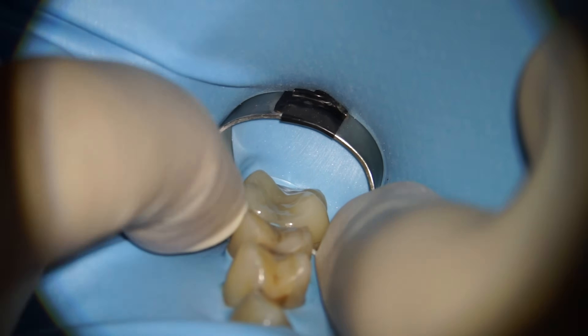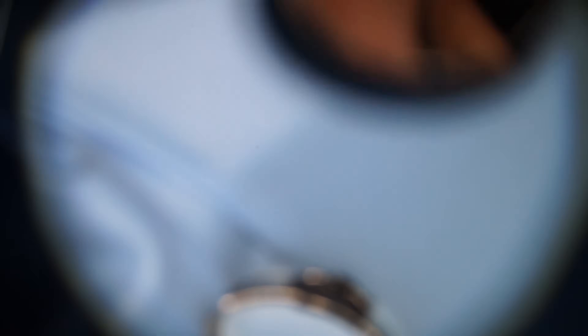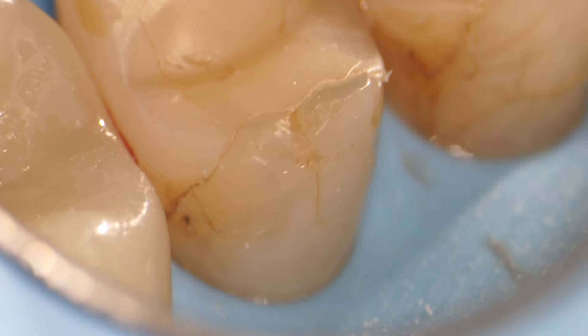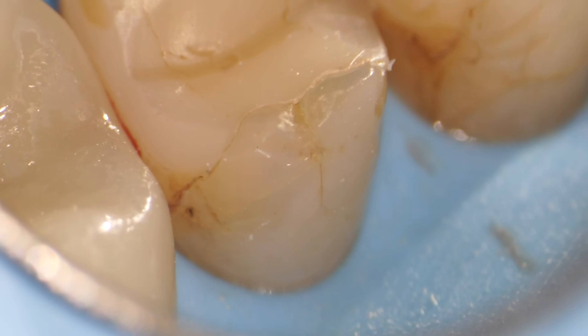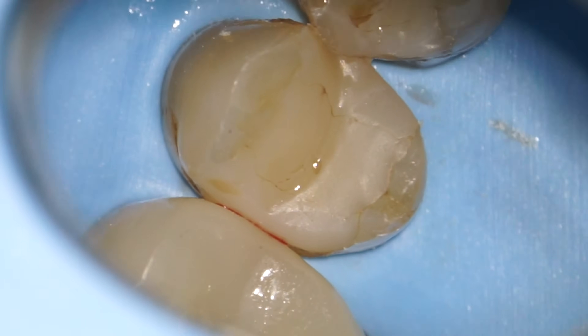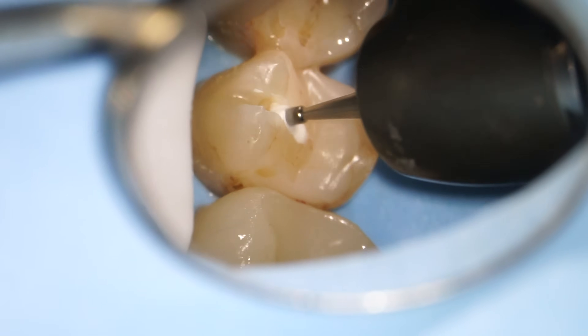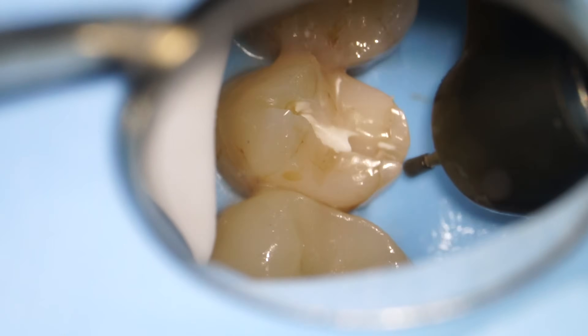So why would a dental crown be necessary? When a tooth has a really large filling, it's possible for the tooth structure around the filling to start cracking, as you can see in this case. The first step in a dental crown is to actually remove the top two millimeters of the tooth structure — that's the chewing surface that we're removing two millimeters of natural tooth away from.